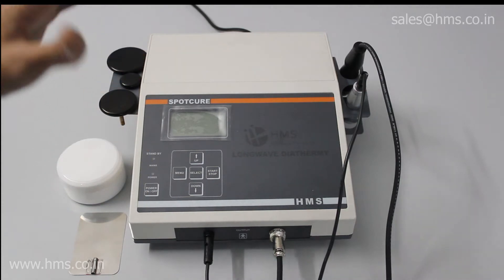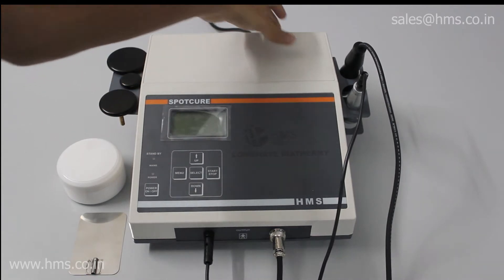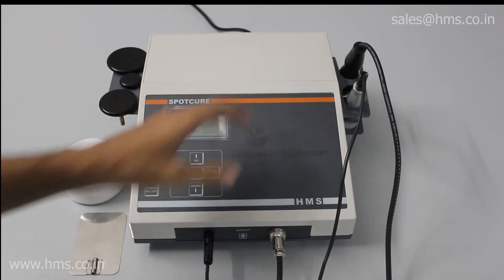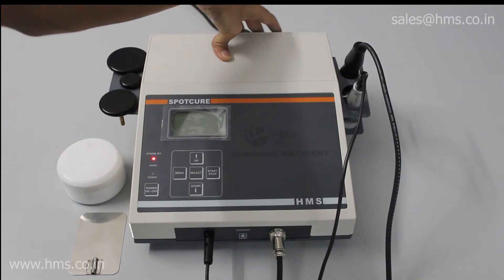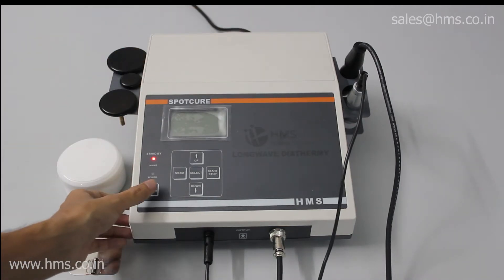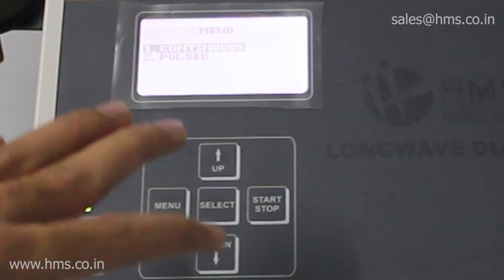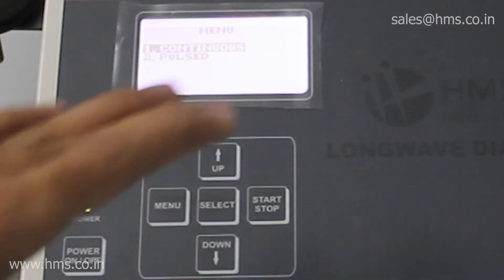Now we'll switch on the equipment and see what features are available with the Spot Cure. Switching on is very simple — you just have to plug in the power cable to the rear and switch on the button near the power socket, then press the power-on button. All these keys are capacitive keys and they are very easy to use and very responsive.